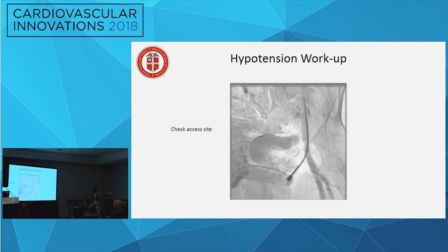We routinely give aminophylline beforehand to combat the hypotension from the release of adenosine during atherectomy. I have not seen it present like this, but you definitely see it acutely. So I don't know if that was a concern or not. Now with the aminophylline shortage, we're using caffeine, but it's another option or another issue. It's also more common in the right coronary artery, which is occluded. You worked on the LAD, so.